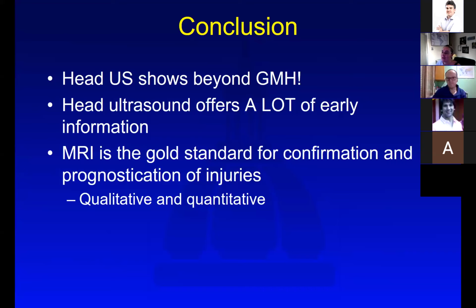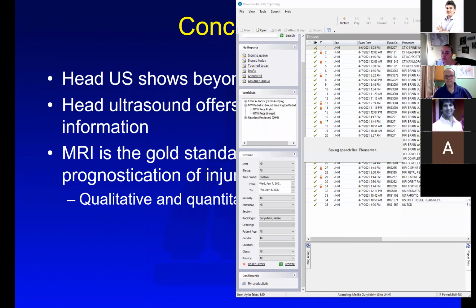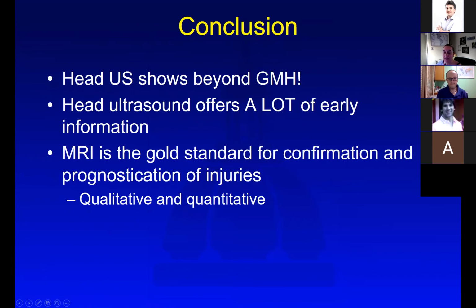And I can see one of the questions which our colleague from Uruguay, right, Nicolas, asked if we use MRS in diagnosis of HIE. It's not our standard part of the protocol. We do not think it is necessary to use MRS to come to conclusion in these infants. So it's not our standard part of our protocol.